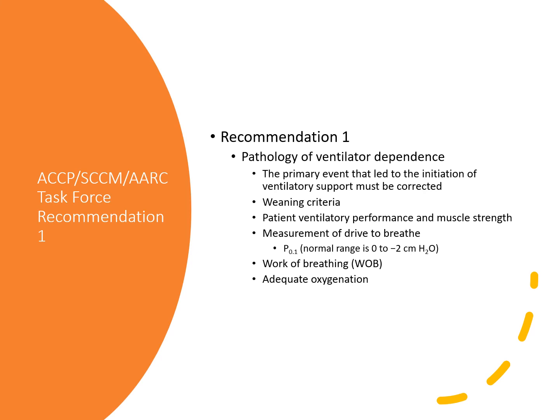So whatever led them to being on the ventilator should have been improved or reversed, or their overall medical condition, and everything that caused them to have that work of breathing has been reduced. What if their psychological readiness is not there as well? So those are all things that we have to think about. We need to look at the patient's overall condition, and any ventilator parameter or physiologic parameter outside normal range could interfere with their ability to breathe spontaneously without vent support.